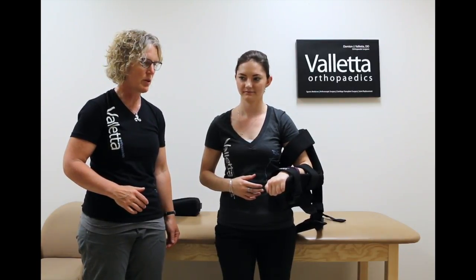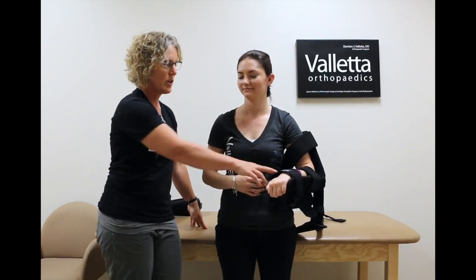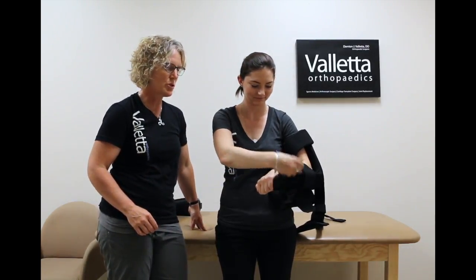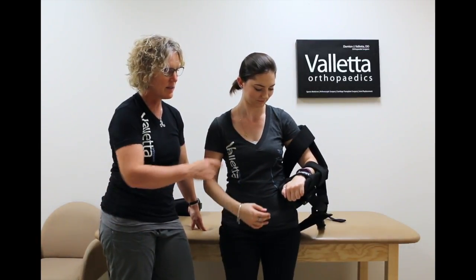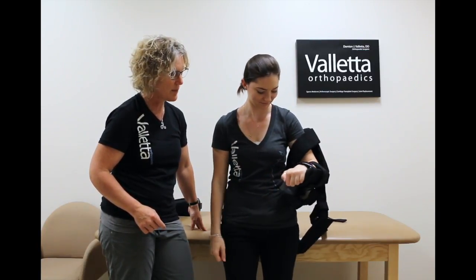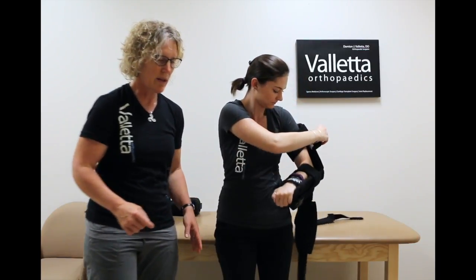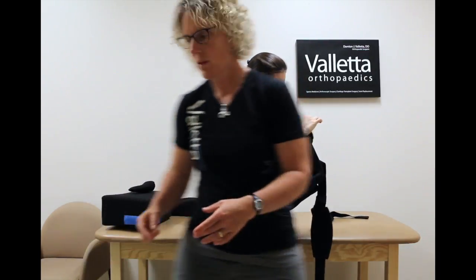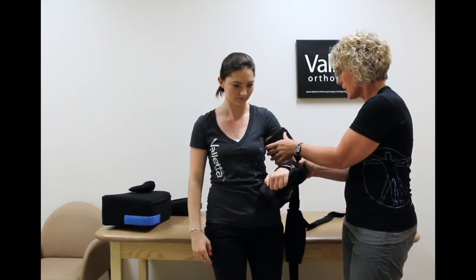We're going to learn how to put the brace on. So Elizabeth, first thing you're going to do is grab the straps. Strap the bottom one, the top, cinch it. Then the second strap, strap it, and then the top strap. These need to be pretty secure, so it's helpful if you have someone hold it too and maybe even cinch it a little tighter.